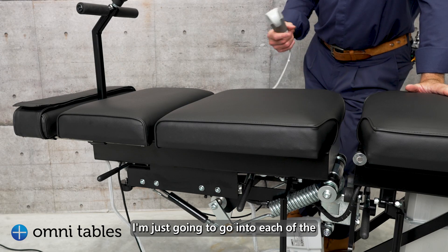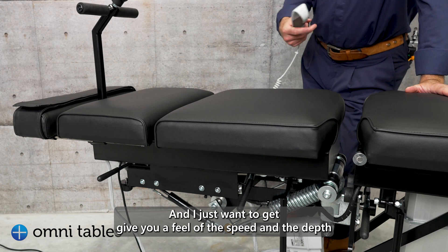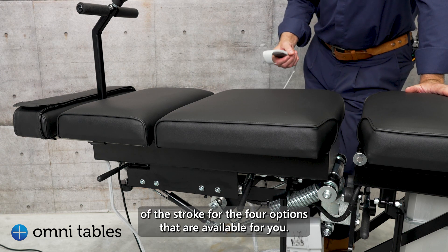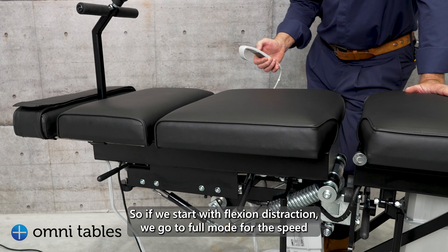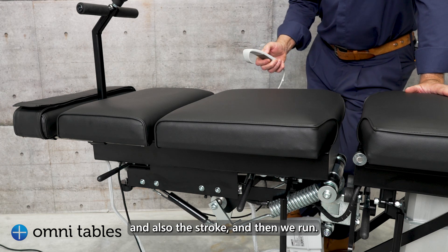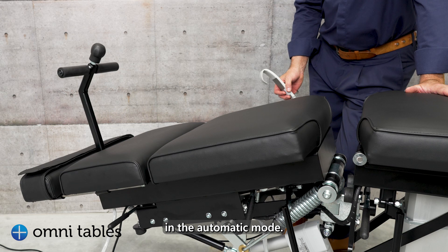I'm going to go into each of the functions for our new big kahuna, the Flexion Distraction table, and give you a feel for the speed and the depth of the stroke for the four options available. Starting with flexion distraction, we go to full mode for speed and stroke, and then we run — so this is the full function or full depth in the automatic mode.